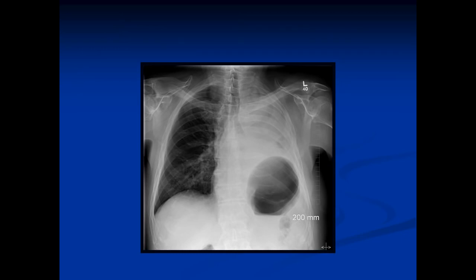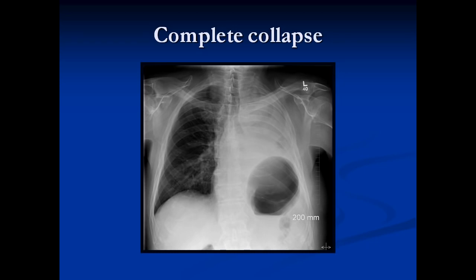What's happened here? We've got consolidation involving all that we can see of the left lung. We've also got evidence of volume loss — a tracheal shift and the diaphragm is shifted up. Looking very carefully, this is a complete collapse of the left lung. The main stem bronchus is amputated centrally — it's occluded. We've occluded the main stem bronchus, and there's complete collapse of the left lung.